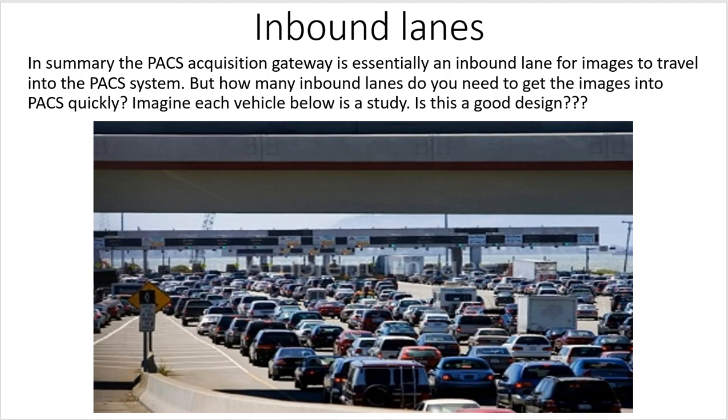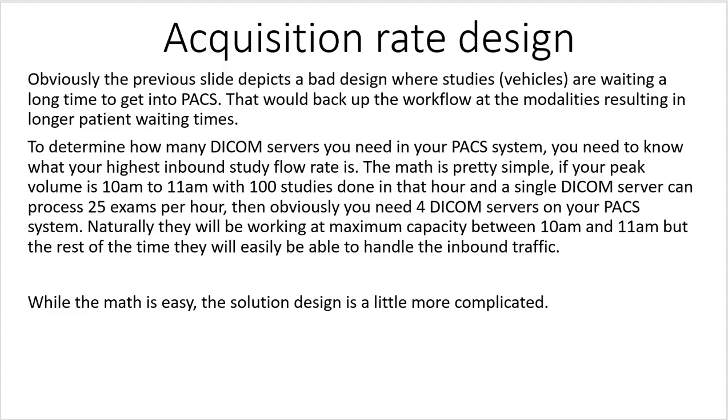But how many inbound lanes do you need to get the images into PACS quickly? Look at this picture below and imagine each vehicle is a study. Is this going to be a good design? Obviously, the previous slide depicts a bad design where studies, aka vehicles, are waiting a long time to get into PACS. That would back up the workflow at the modalities, resulting in longer patient wait times.